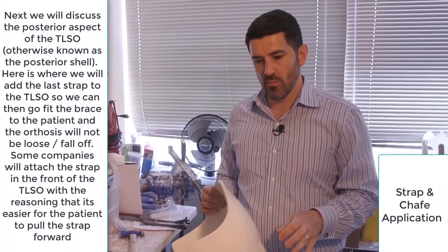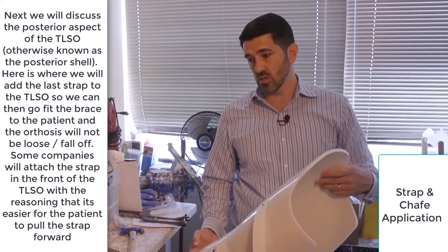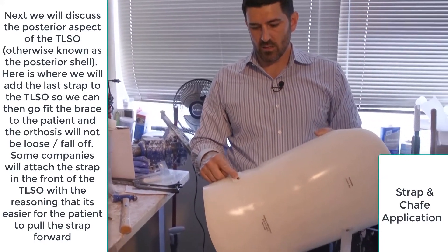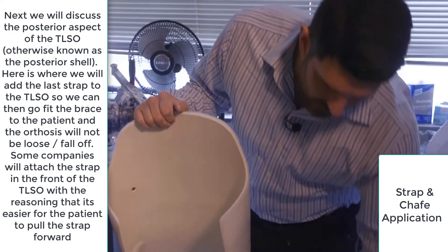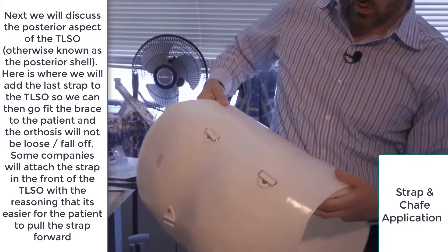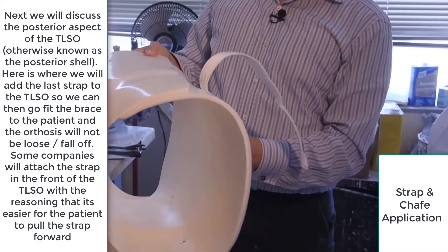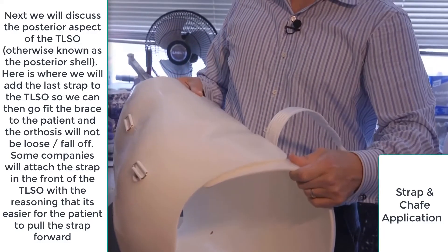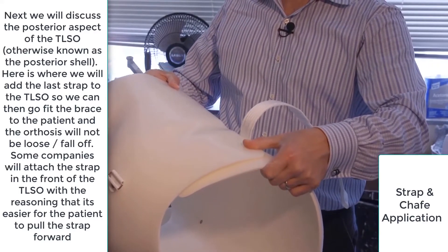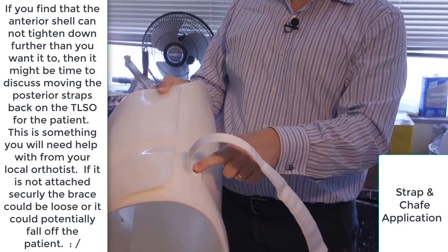Now we're going to show you the posterior aspect of the TLSO and how we attach the strap in the back. This is important as you deal more with bracing: if the front piece overlaps the back and these straps are not far enough back on the posterior aspect, what can happen is — you always want this brace to be snug — if the front piece hits right underneath that rivet, it will stop being able to tighten down.